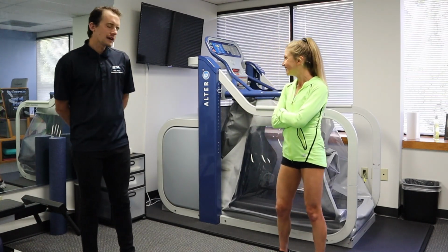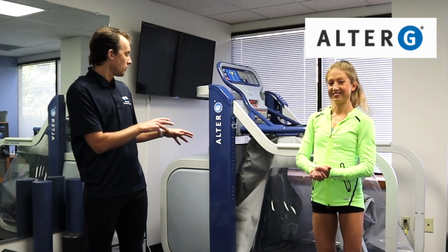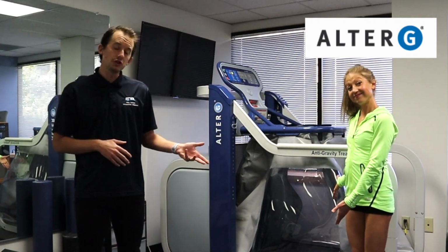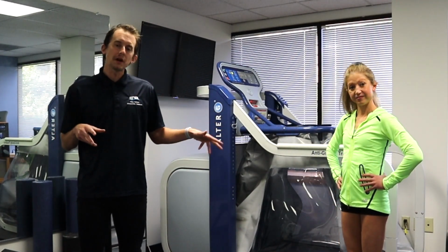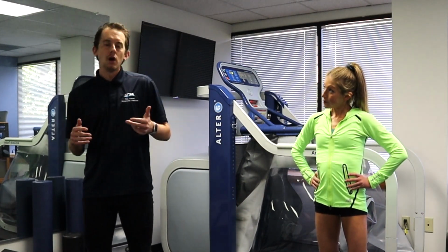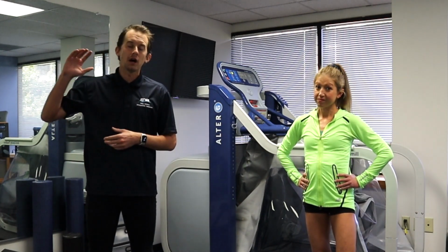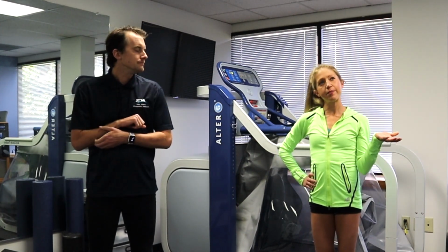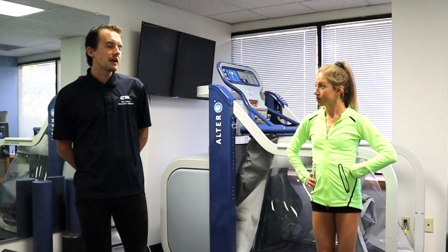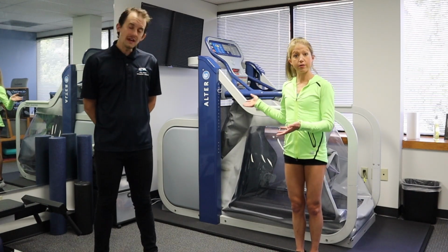Hey Caroline, yeah, so an anti-gravity or commonly known as an AlterG treadmill is a treadmill that's inside of a chamber you can see here, and basically what it allows us to do is someone wears a special pair of shorts and they can walk or run at a percentage less than their body weight. So think about everything below kind of where the back is, you would get less impact than yourself on Earth. So running at less of my percentage of body weight, meaning I could run at 50% of my body weight. Yeah, so think about it, if someone hypothetically weighs 100 pounds, we could make them weigh 50 pounds on the anti-gravity treadmill. On the anti-gravity treadmill, yeah.